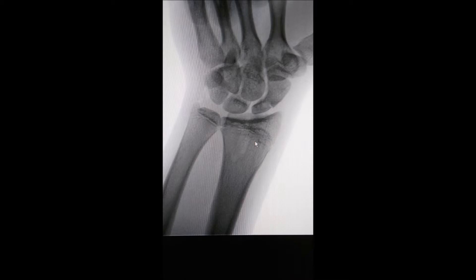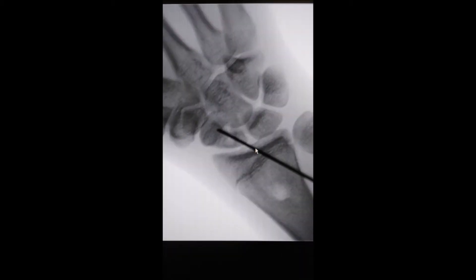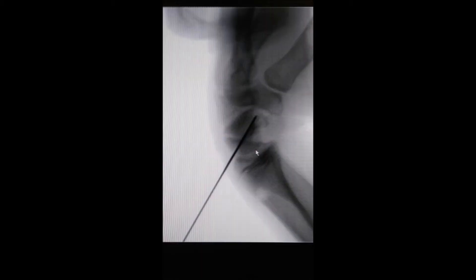In this case we took the graft from the forearm itself, that is the distal radius, but in many other cases we need to take a small piece of bone from the hip to substitute the loss of bone that occurs because of the non-union. Here we have prepared the bone edges up to bleeding bone, and this is the x-ray image after we have done that. Then we proceeded to take a small bit of bone from the distal radius and put it in between the two fracture ends in the spaces, and fixed it temporarily with a pin. We check the correct placement of the pin on the x-ray and then proceed to fix it with a screw, which is the most important step in the whole procedure.